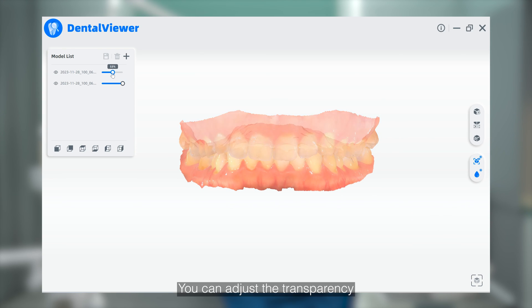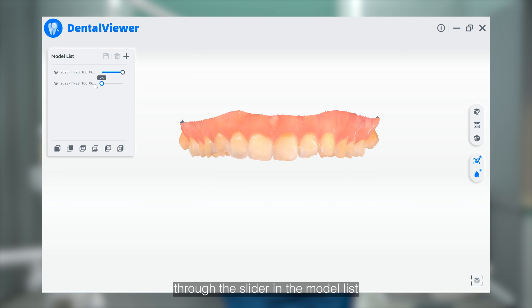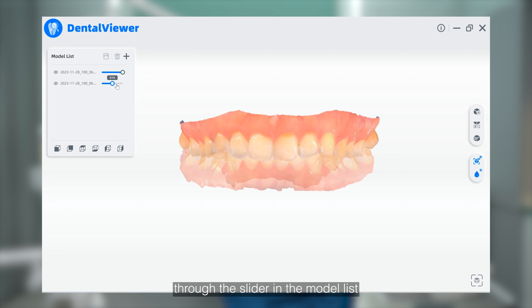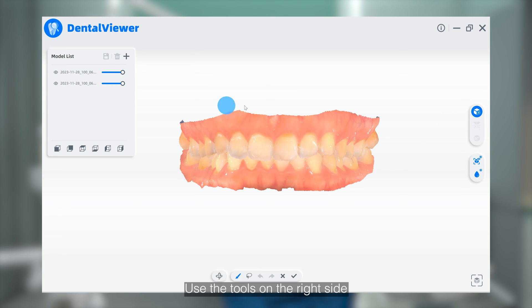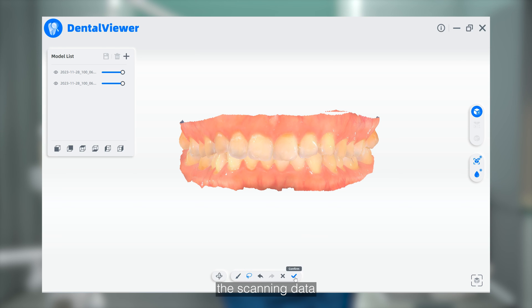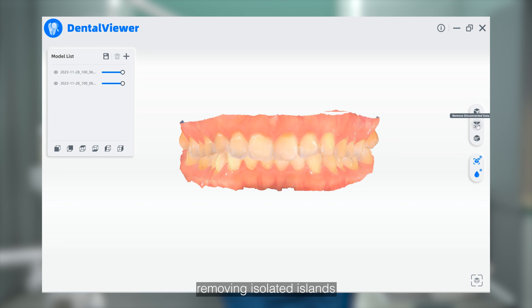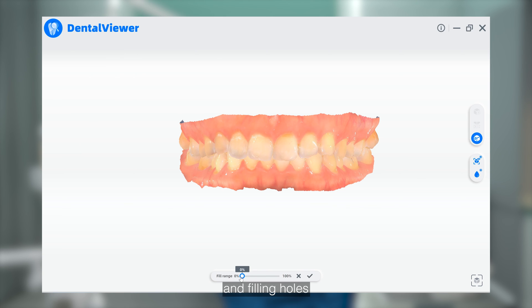You can adjust the transparency of the model data through the slider in the model list. Use the tools on the right side of the interface to add or optimize the scanning data, including data editing, removing isolated islands, and filling holes.